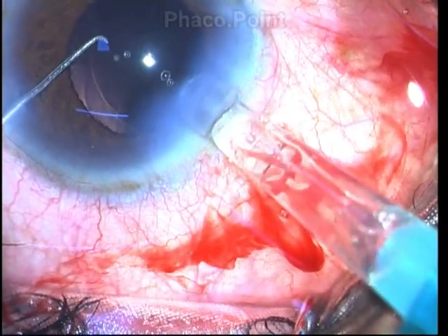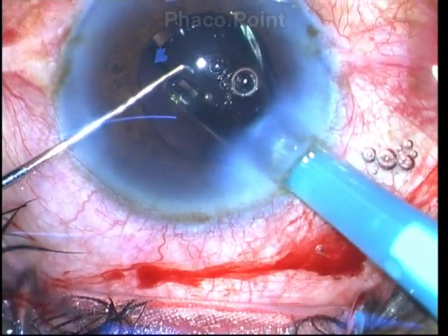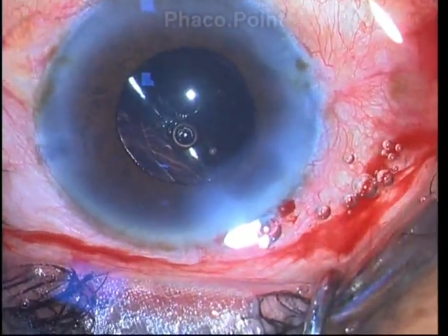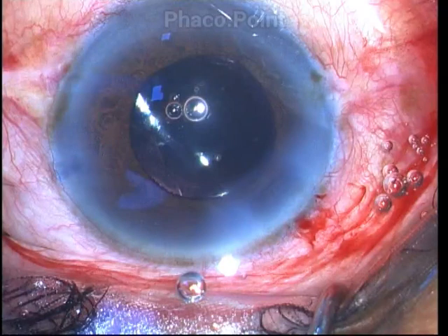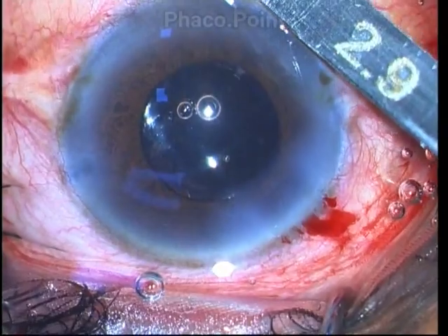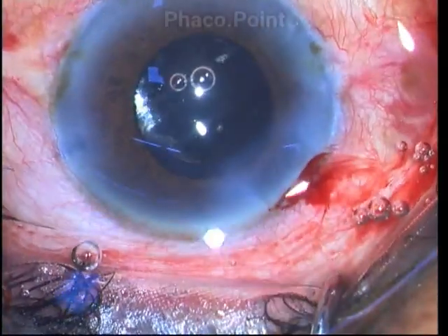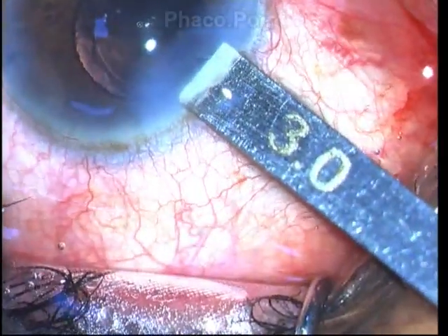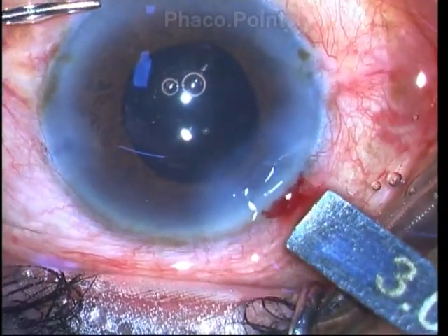Unlike the first case example, I am now performing a wound-assisted injection where the nozzle tip is placed at the clear corneal incision site and the IOL is injected carefully into the capsular bag. Measuring the incision afterwards, there is not much gape or distortion of the clear corneal wound. The 2.9 mm caliper can now pass, however it is difficult to pass the 3 mm caliper. This means there is an enlargement of just 0.1 mm when using the docking method of implantation.